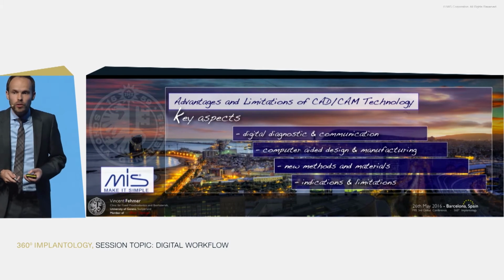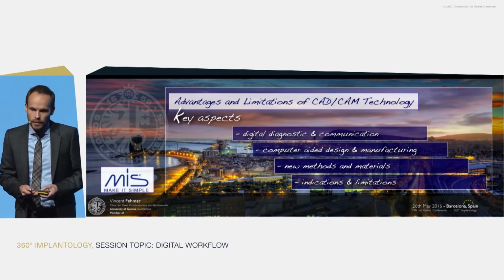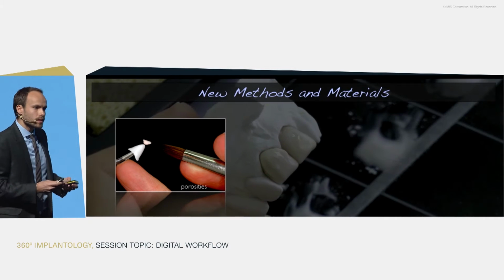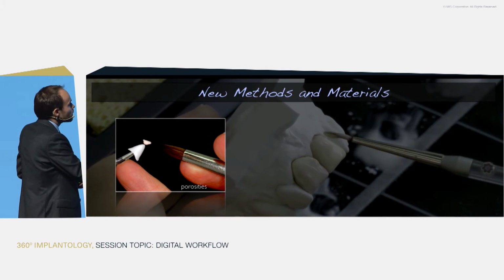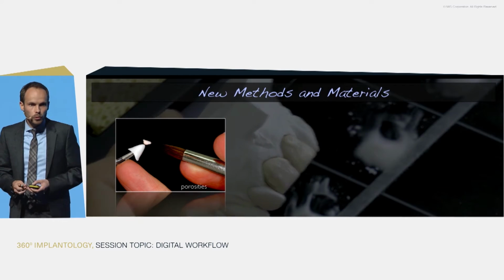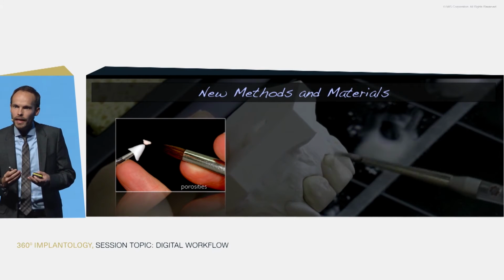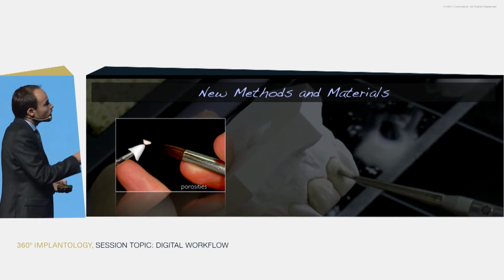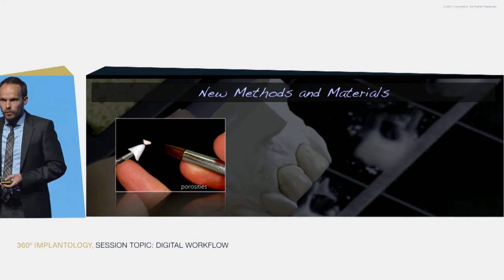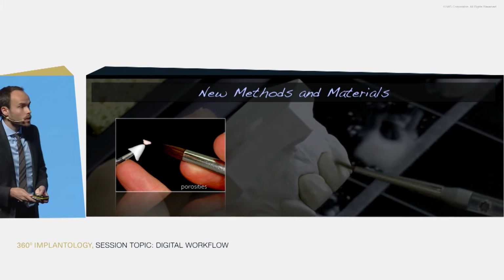So are there any new ways where we can eliminate this problem of the chippings? And I think there is. The problem with this aspect is that what dental technicians love to do the most, and what we saw so beautifully documented also in other lectures, is layering ceramic, adding porcelain to our reconstruction, creating and giving all these beautiful surfaces, the colors and all the details that we are trained so hard for.